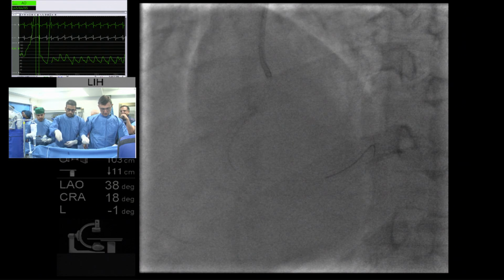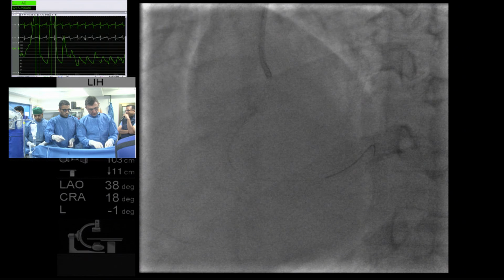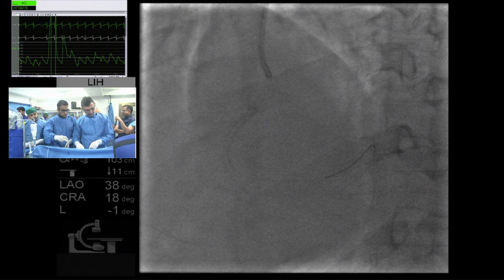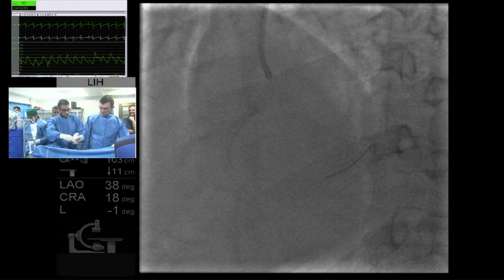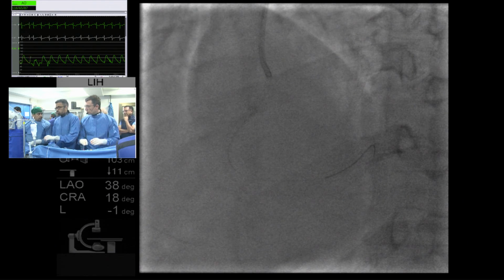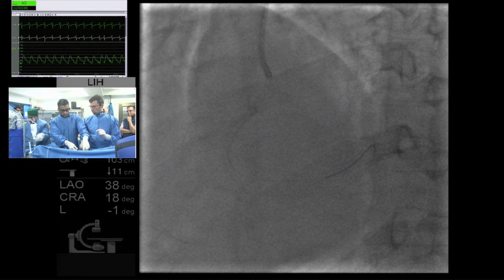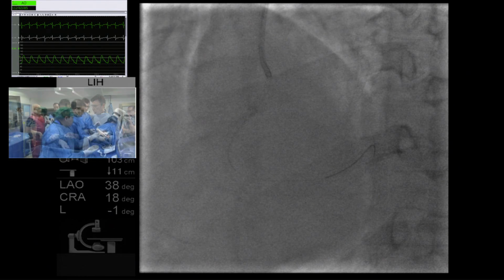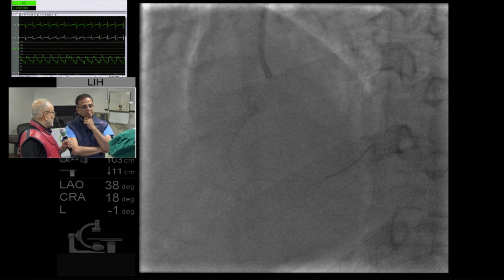It could even vertically deform the stent if you hit the stent, especially these synergy stents, huh? Well, all these third generation stents. It used to happen frequently with Promus Element. With Synergy again, but I want to discuss this from the panel. Let's get the OCT. Stainless steel, which is not used nowadays, cobalt chromium and platinum chromium, these three platforms. What do you think about foreshortening, and what do you think about the radial strength?